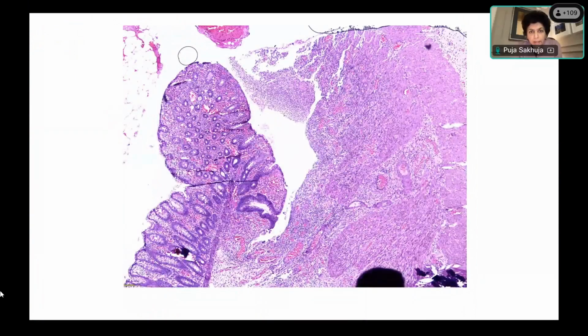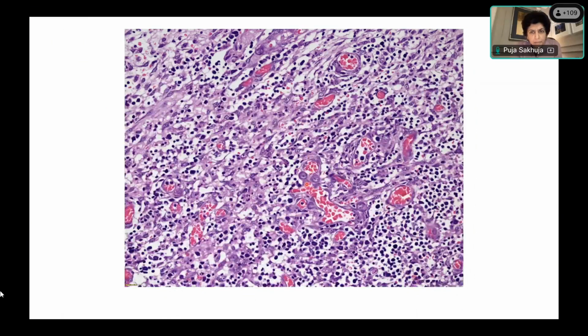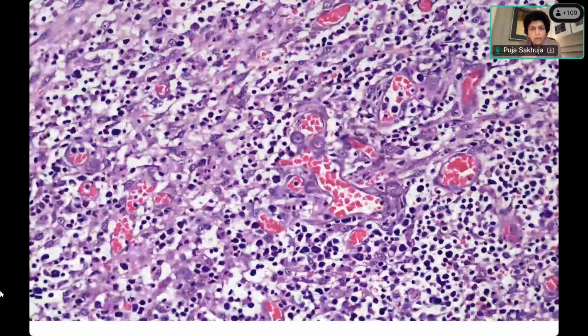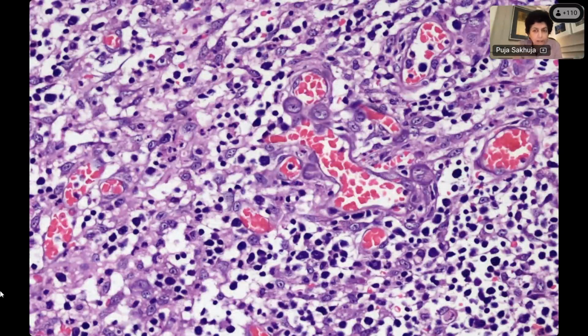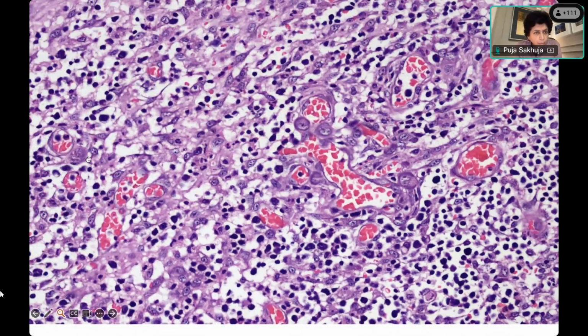In the next slide, I think you can see the cytomegalic cells with cytoplasmic and intranuclear inclusions. Did everyone manage to see these? Was there anyone who did not see them? Anyway, it doesn't matter. Now you see them. So you have to be careful when you are looking.